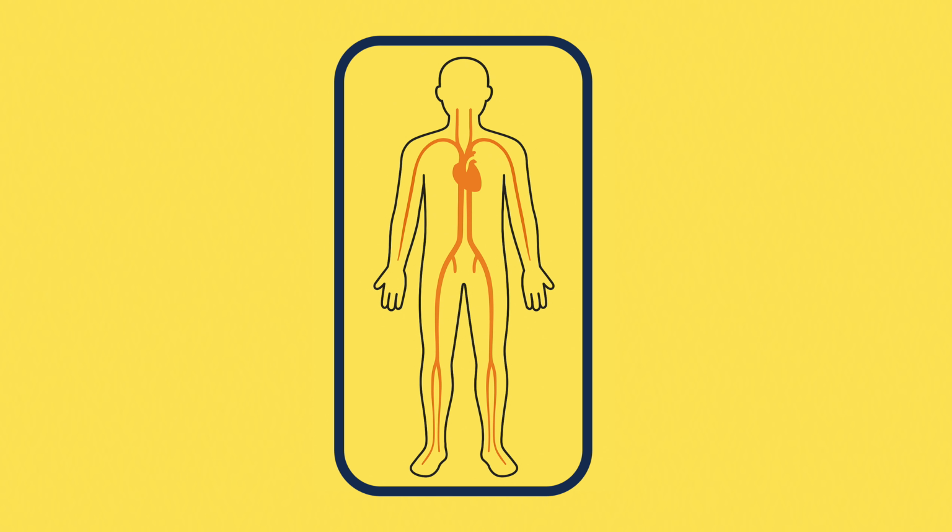So we've now discussed what ECMO is, the different types of ECMO, VA and VV ECMO, and when we should and shouldn't use them. Now let's discuss cannulation. The key terms of cannulation include the drainage cannula, the cannula which removes blood from the patient into the ECMO circuit, and the return cannula, the cannula returning blood back to the patient.